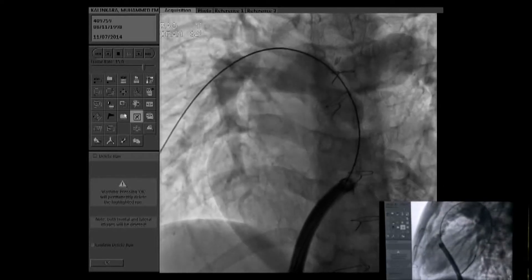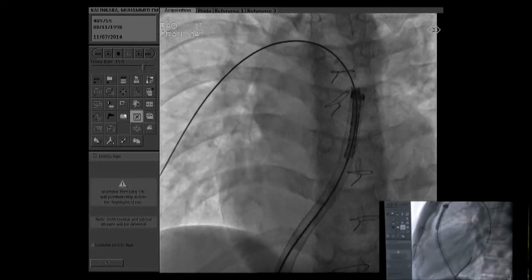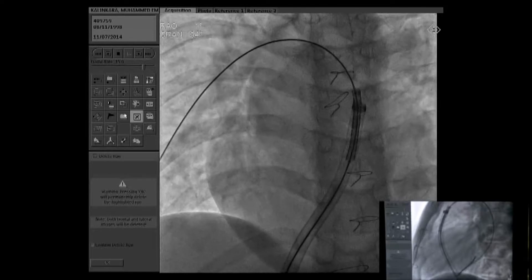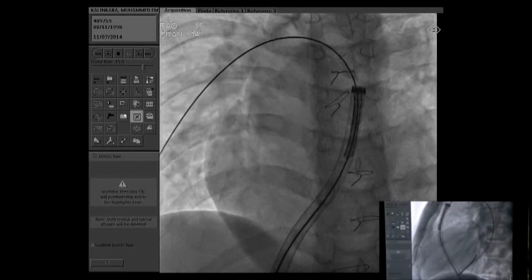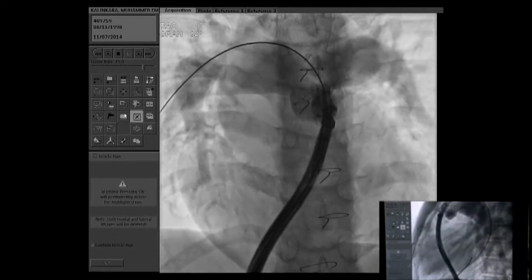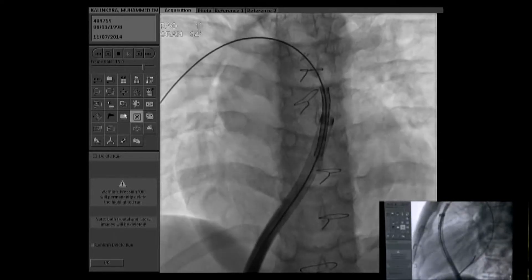That should shorten to about 30mm. We have seen the last image. By the way, we inserted an 18 French sheath, and then after mounting on the balloon. Can you see biplane? Yes. Let's see the other view. Can you see biplane? Can we have maybe lateral? It's good. Excellent. Can you see the lateral as well? Yeah, it's very good. We see it all.